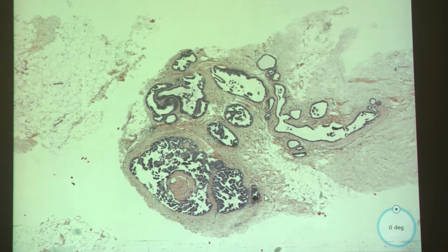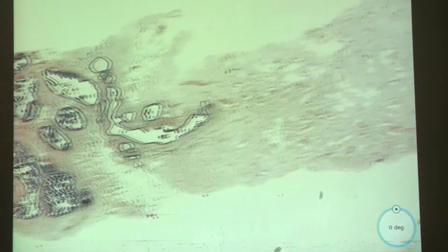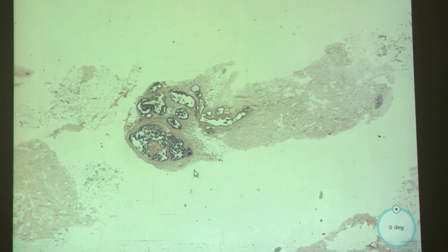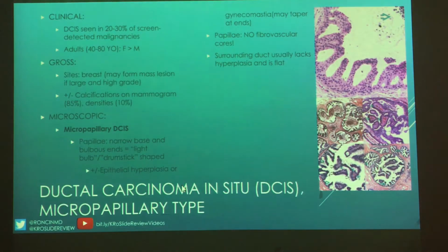There are a few more pieces if you drive around, but mostly it's cystic spaces with micropapillary parts that are just falling off in them. I'm surprised we haven't seen more of these in our cases here. Well, micropapillary, thankfully, is rare. And that's a good thing, because anything micropapillary, with one or two exceptions, is bad.